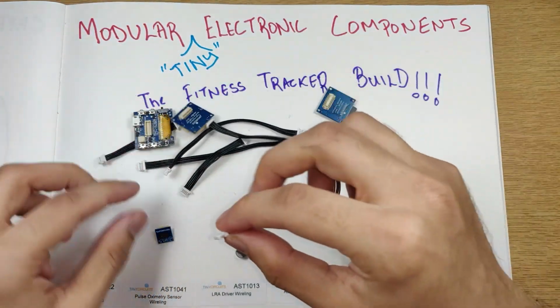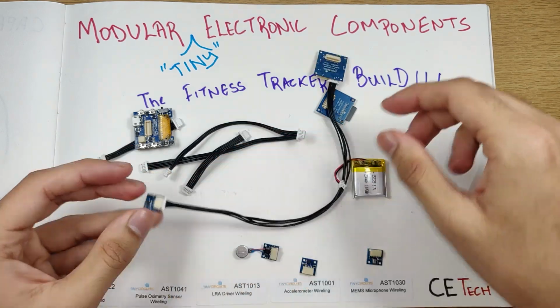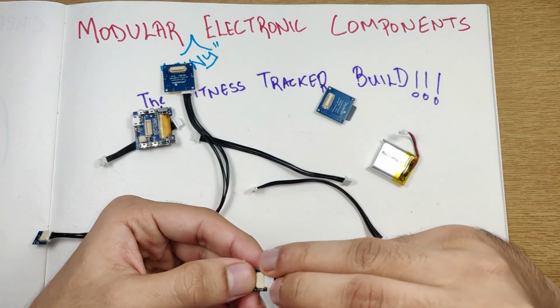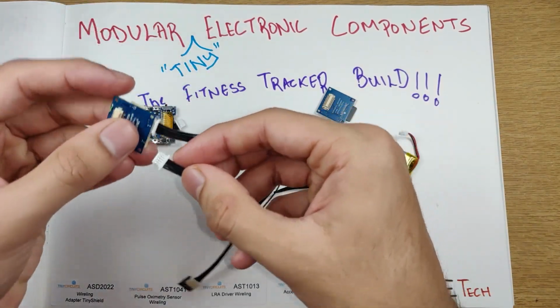I attach this over here, and then I'll quickly attach the oximeter over here. That goes like a snap. Then I'll connect the vibrator or the LRA driver module to port number 2, which is over there.